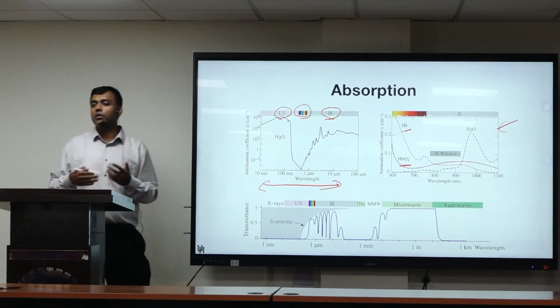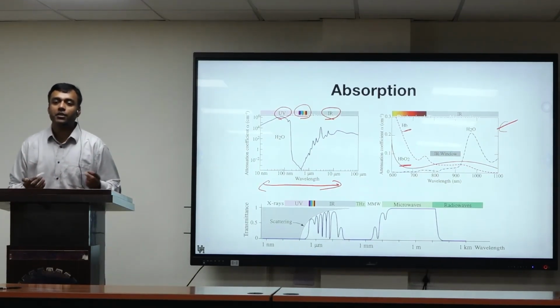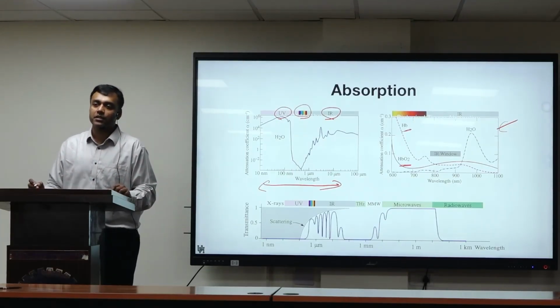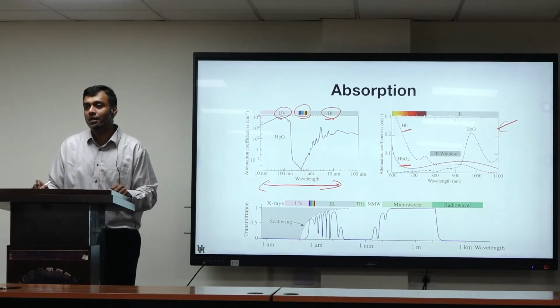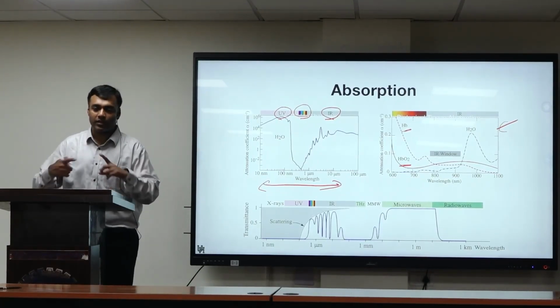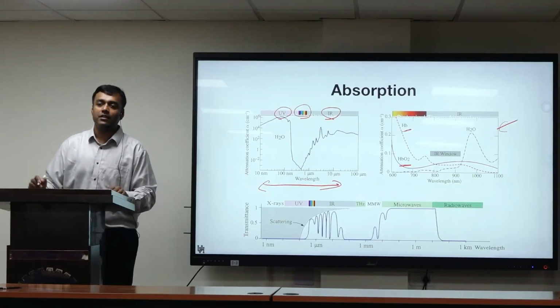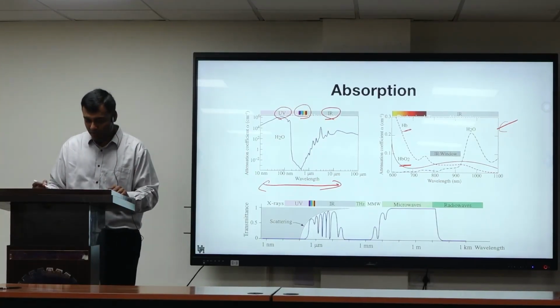It can also tell you the blood oxygen saturation, how much oxygen there is in your blood, which can be crucial. If it goes too low, then the person needs immediate medical attention. The doctors and nurses will run towards the patient, because if it takes too long, the person could die. So it's crucial. That's why they keep it on the bedside, and that's one of the devices that is built based on spectroscopy.